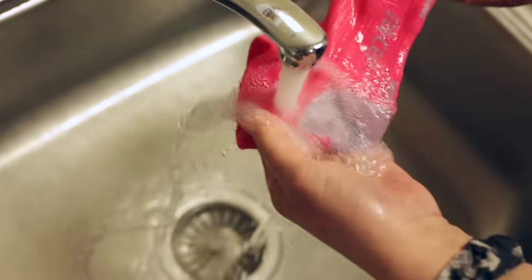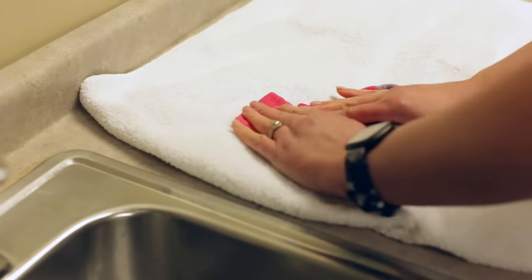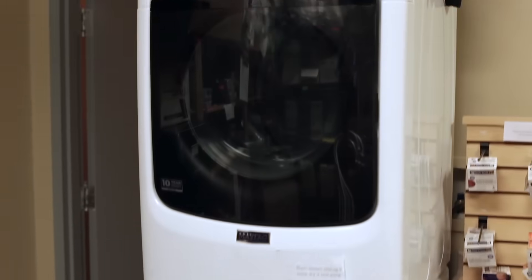It is best to wash your socks after each use. To dry, you will hang or lay flat. Do not place in the dryer.